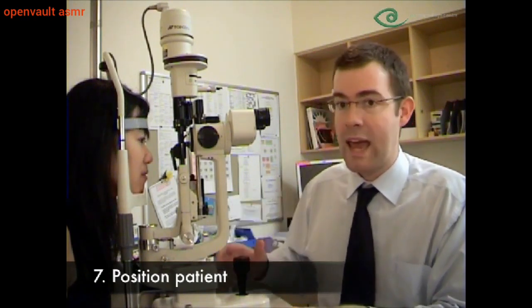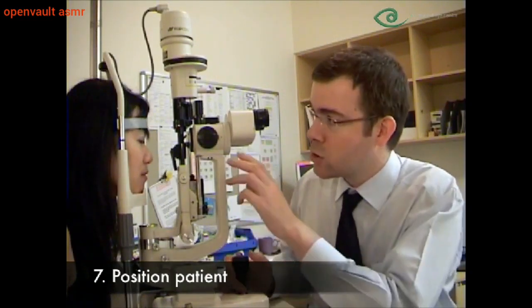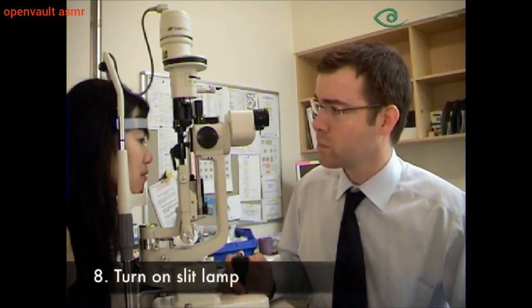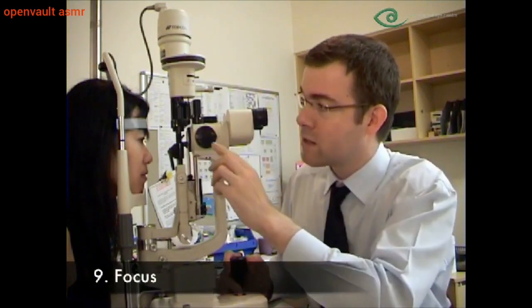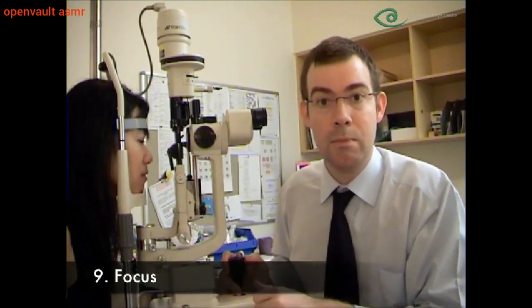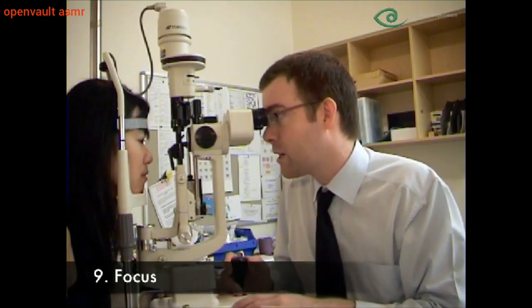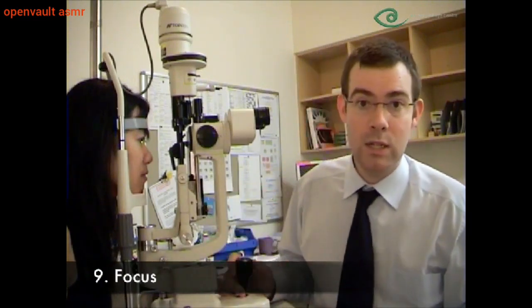You should use one hand on the joystick and the other hand to control illumination. Make sure the slit lamp's not pointed directly at the patient's eye and turn on the lamp. You can focus it coarsely just by moving the slit lamp forwards until the beam becomes crisp and well demarcated, and then look through the eyepieces and adjust the focus accordingly. You want to start with a broad beam, relatively low intensity and a low magnification.